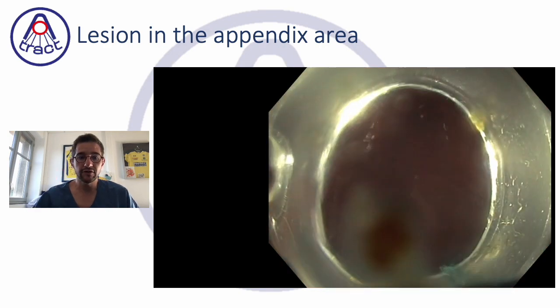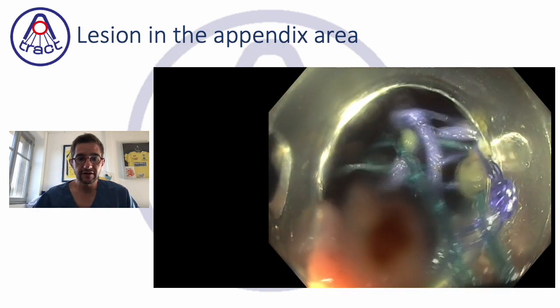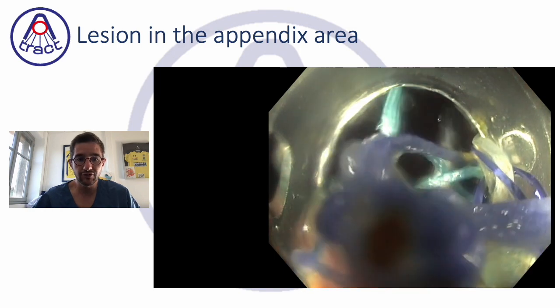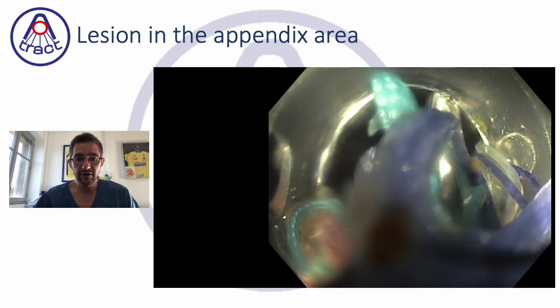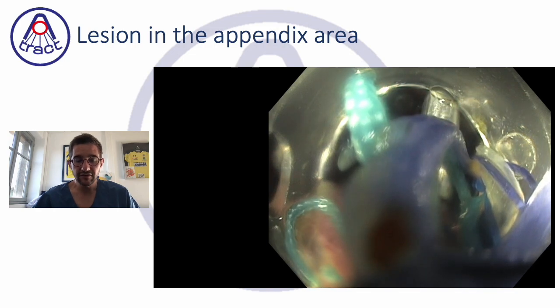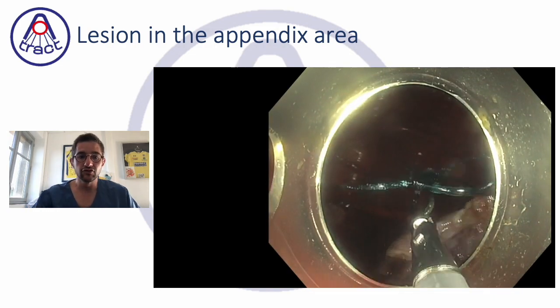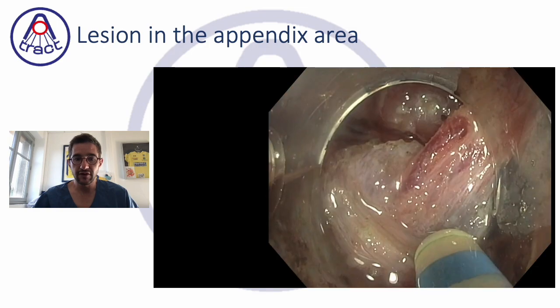And the key point of the resection is that we should improve the traction, increase the traction thanks to the adaptive device, or adding a new traction if you have no access to this.